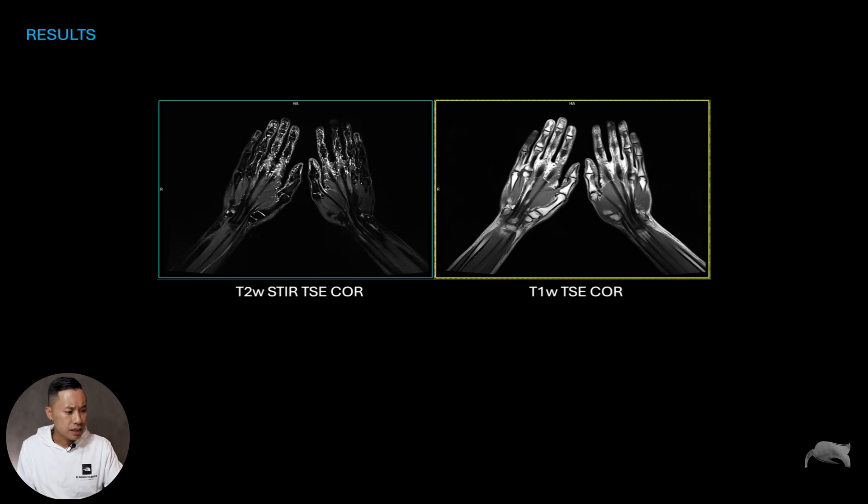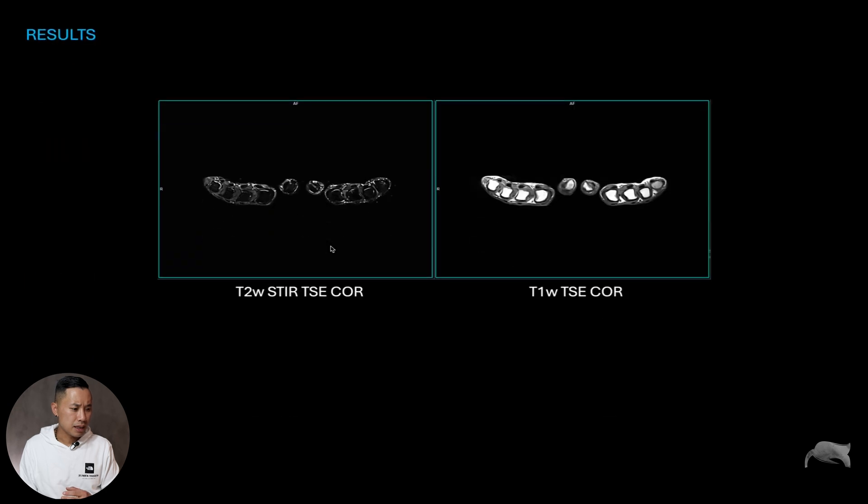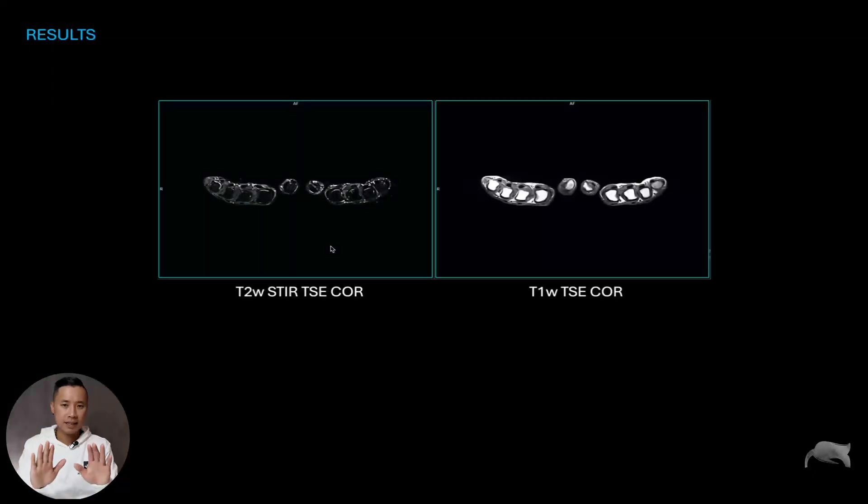Here are the results from a healthy volunteer. We acquired morphologic images like T2 STIR in different planes, giving a great overview of both hands. You can see good coverage and contrast-enhanced MRA showing the contrast arriving — whether the flow is arterial, venous, or mixed. We also acquired images in different planes including transversal and coronal, combined with Deep Resolve AI to speed up acquisition, making it more comfortable for the patient.